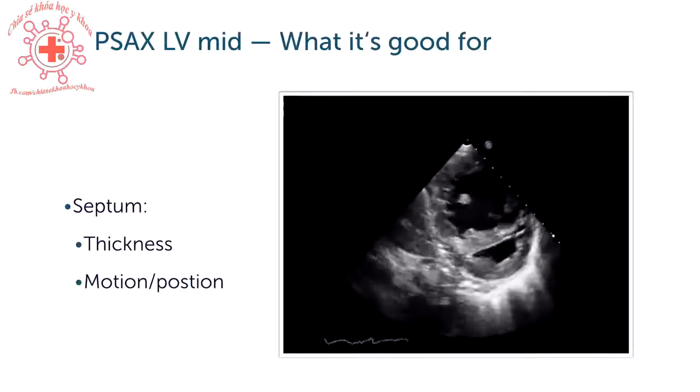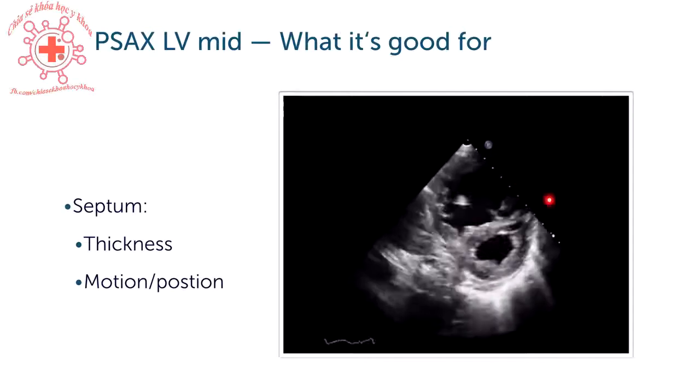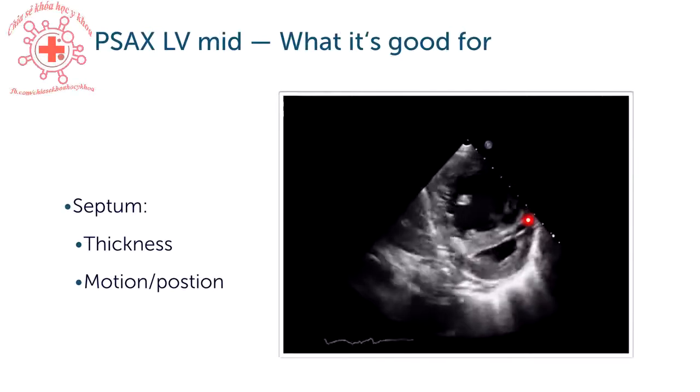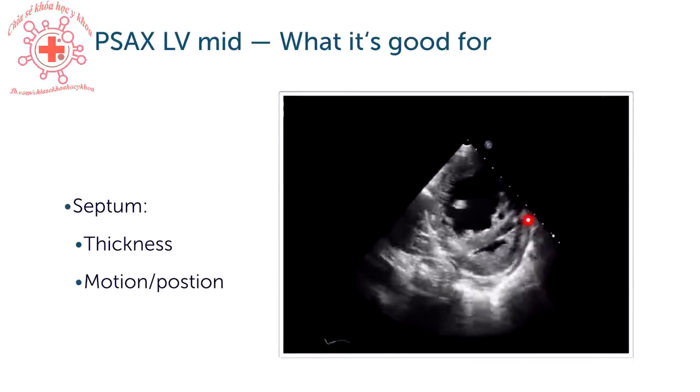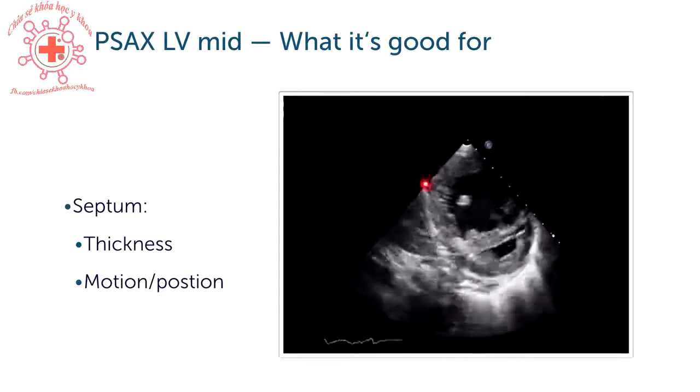I guess all of you realize that this is not a normal echo. Here you have septal flattening in a patient who has severe pulmonary hypertension. In addition, you can assess the thickness of the myocardium, especially the septum, but also of the right ventricle.